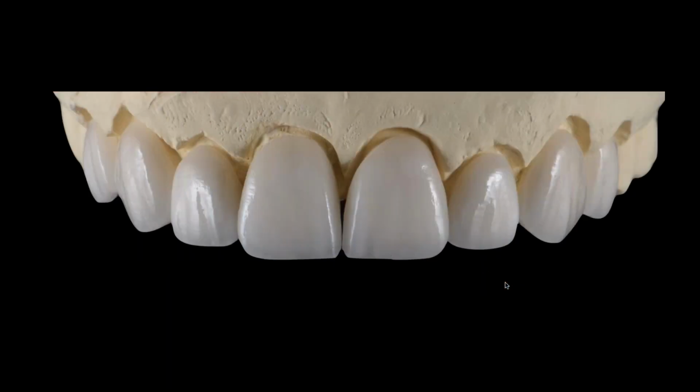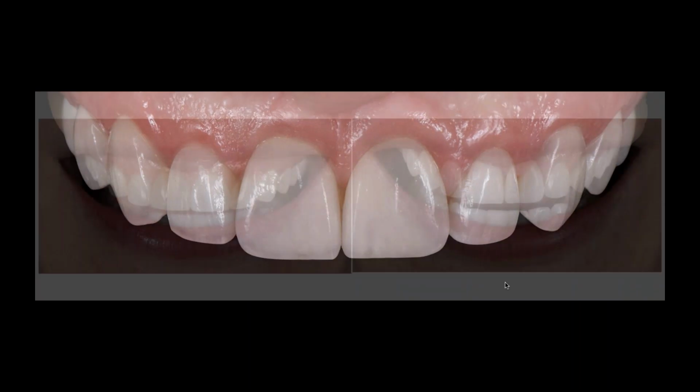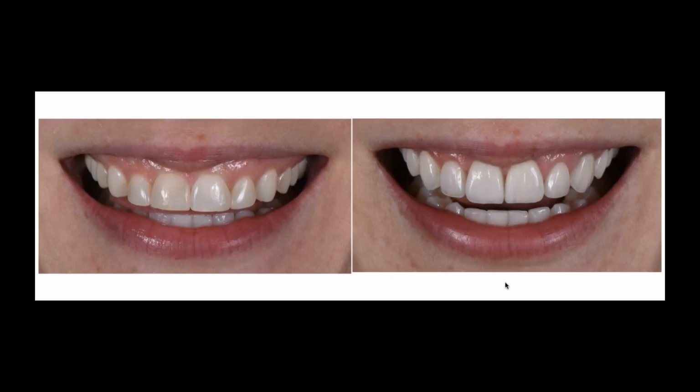And these are, again, VM9 veneers. This is kind of a few-year-old case too. Final restorations on insert, and tissue looks like it's still healing up a little bit, but I think you get the idea. So that finishes us up.